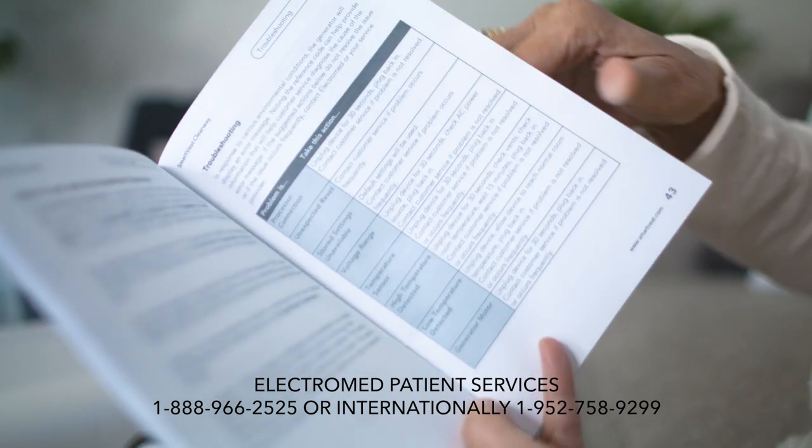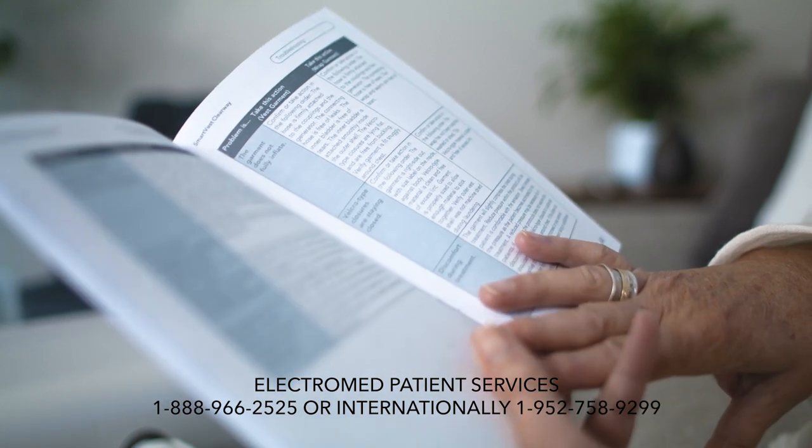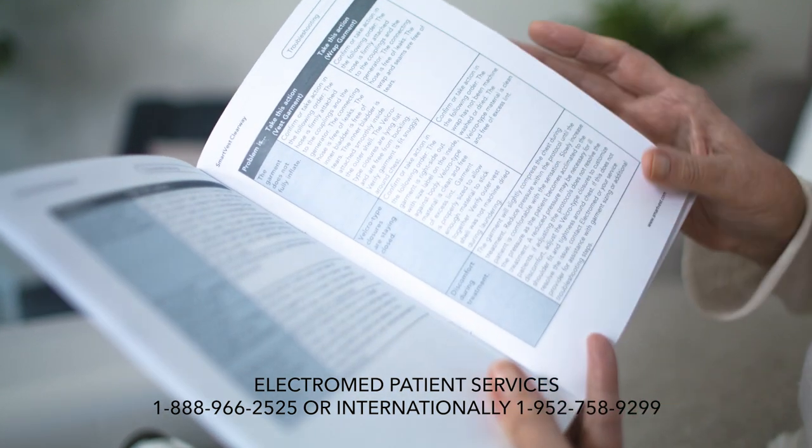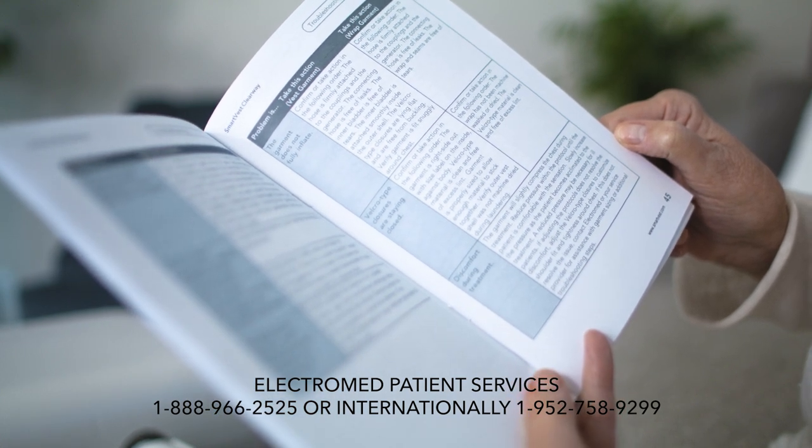If the unit requires servicing, ElectroMed will provide a replacement unit. Please note that any attempted repairs by an unauthorized person will void the SmartVest warranty. All repairs must be performed by an authorized ElectroMed technician.